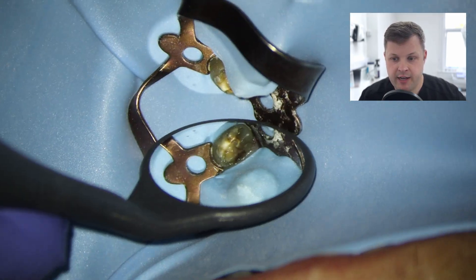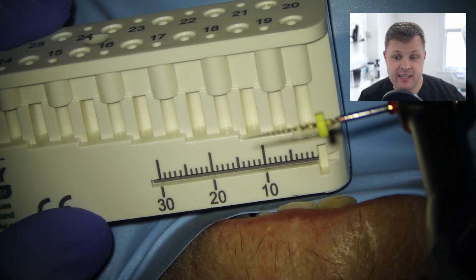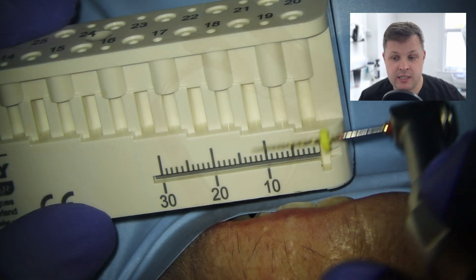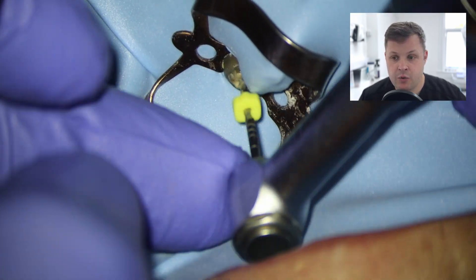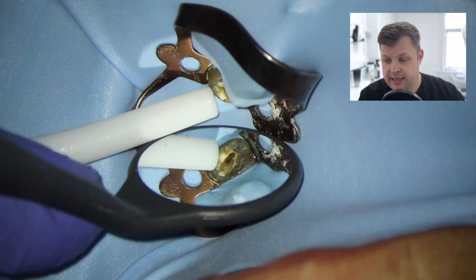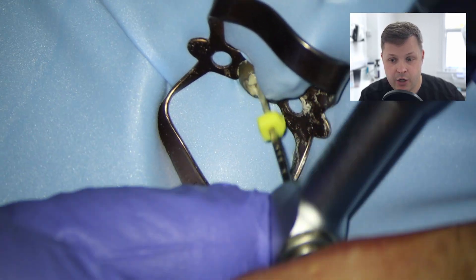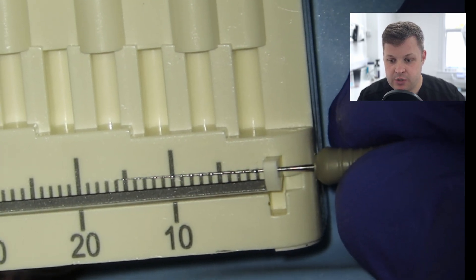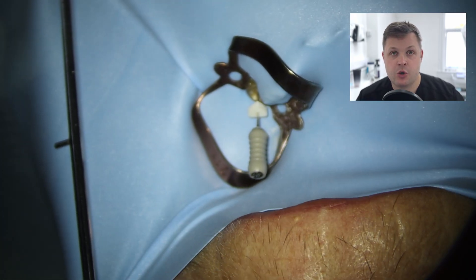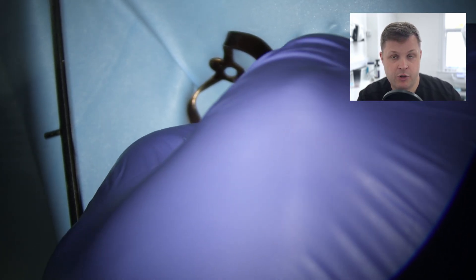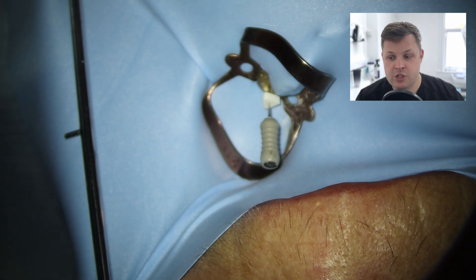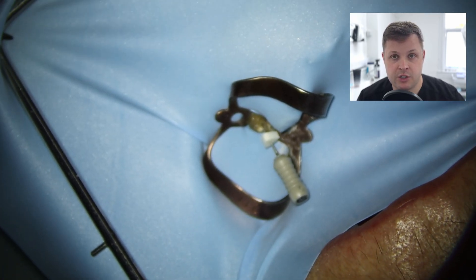Going from a size 10 to 15, now to a 20, placed about one millimetre from the zero reading — around 13 millimetres — this really opens up the canal space. If you can't get to length, it's usually because the canal is gripping the file further up its shank, so opening it up usually allows you to reach length more easily. I'm now using a D-finder, which is smaller than a size 10. Unlike K files with a sharp cutting face along the shank, D finders are essentially a smooth cylinder with a channel cut out, designed just to get to length.